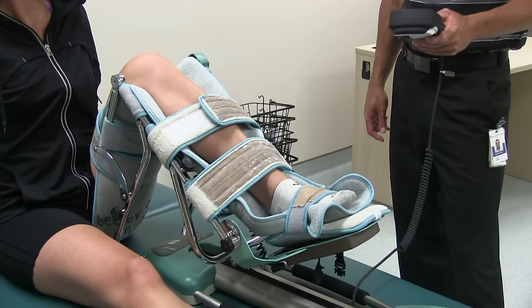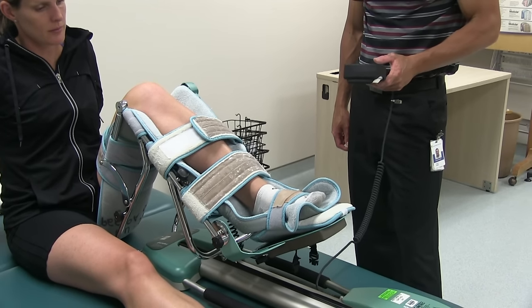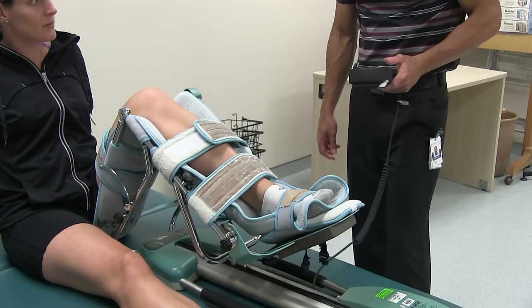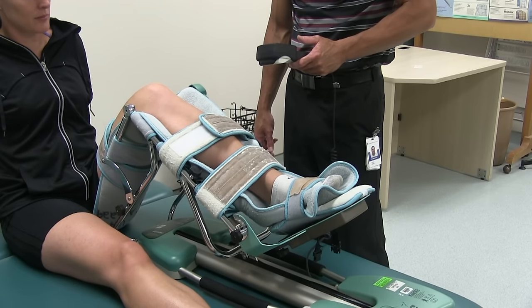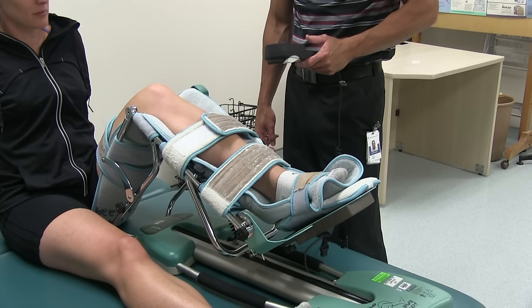We resume from pause and the machine starts to go back into extension — that looks good. You can also adjust the speed as well as the force required to get the knee moving, depending on how the patient is doing with their range of motion while in the machine.